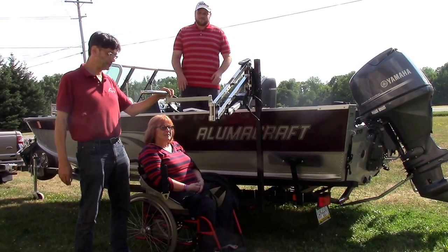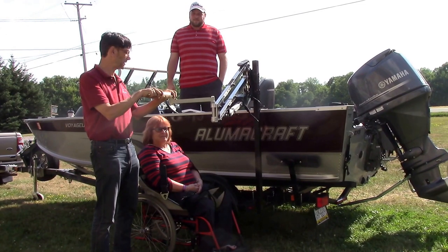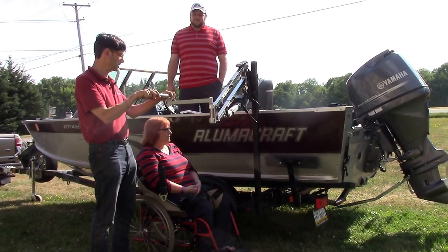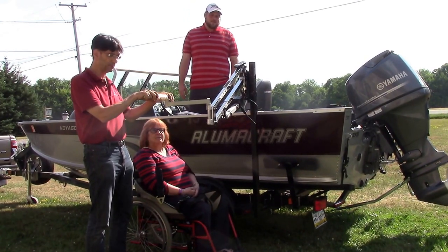Hi and thanks for tuning into our YouTube channel. Today we'd like to introduce you to yet another exciting accessory for the Multilift Personal Transfer Lift System. This is the boat adapter, specifically the trailer adapter for the Multilift system.